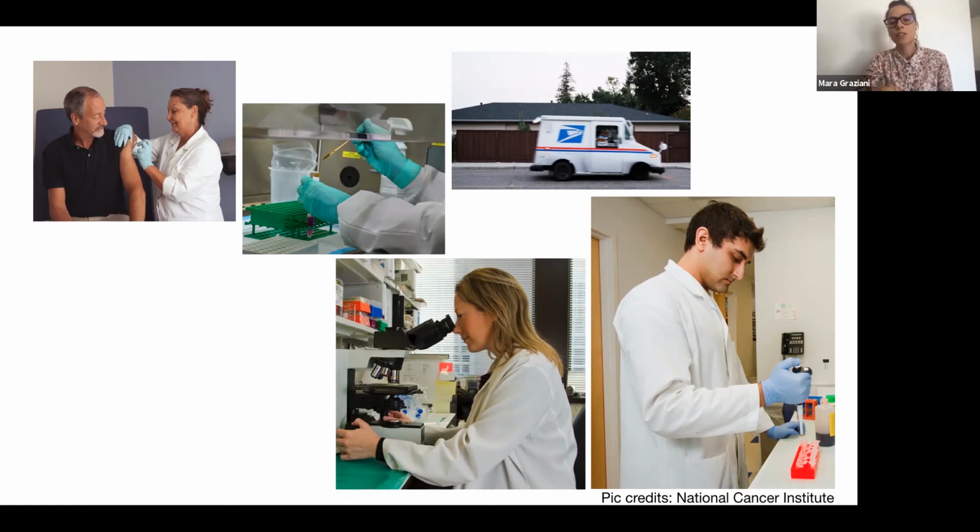Now, the golden standard of pathology uses two types of stain that are called hematoxylin and eosin, and these stains highlight the cells and nuclei and the tissue structures in the slides. And the tissue is then trapped between two thin glass slides. And the pathologist then analyzes the glass slides at the microscope to determine the tumor grade.